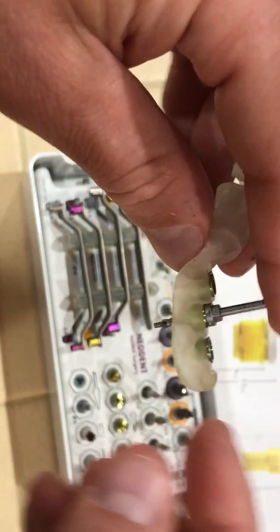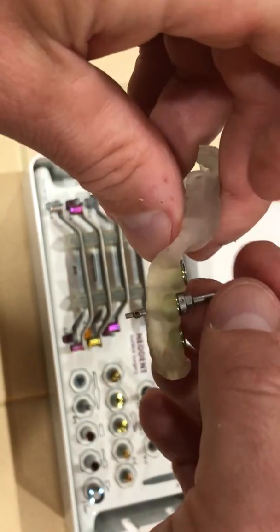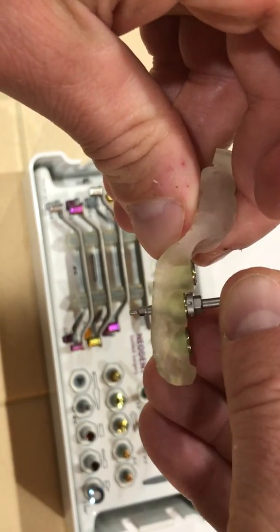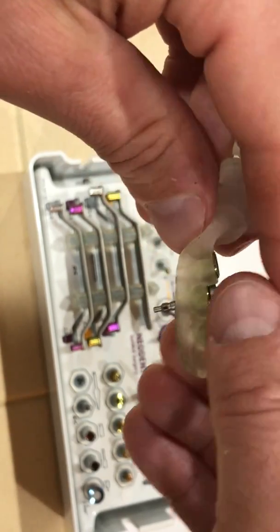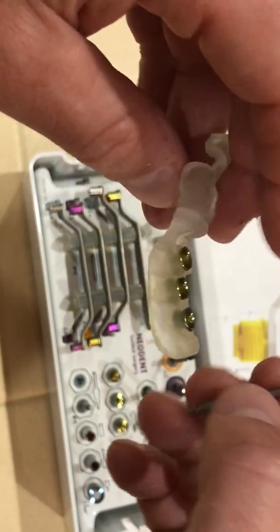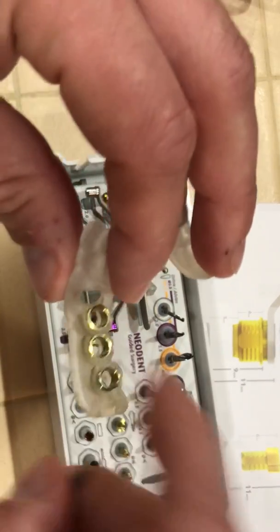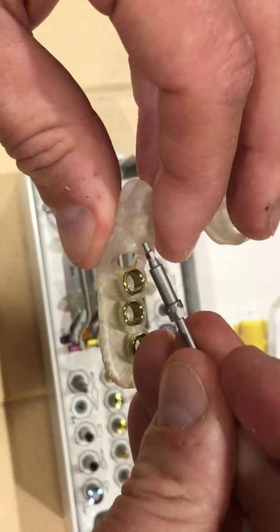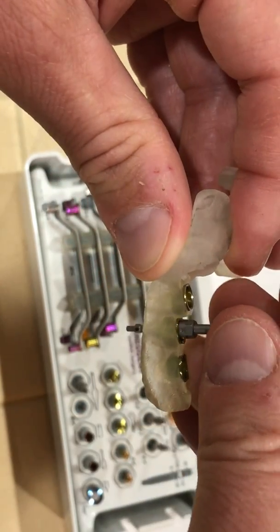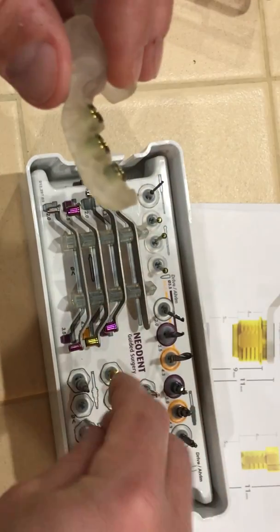I did one of these cases with a doctor and we were done in just over 15 minutes doing two centrals, because we had the depth at 8 and 9 and we also had the timing. The laboratory made a provisional ahead of time that matched right up and it was screw-retained. If the sleeve was magenta, there's a more narrow implant driver — it'll still fit the implants, but the regular driver wouldn't pass through that sleeve.